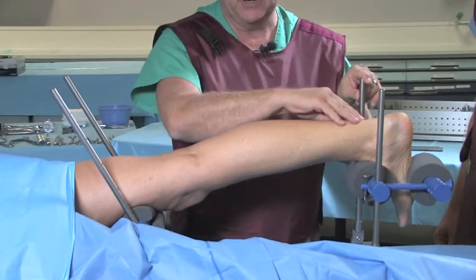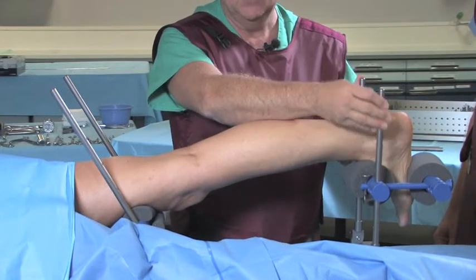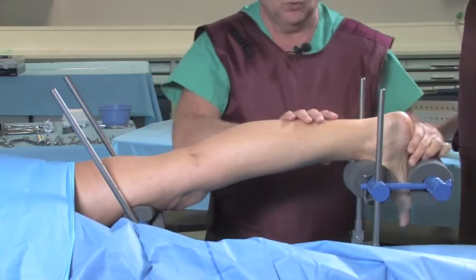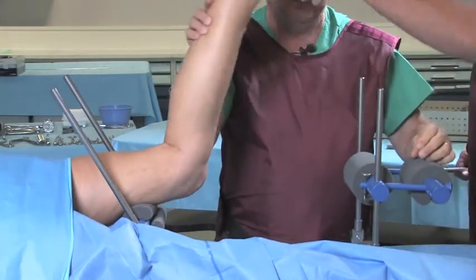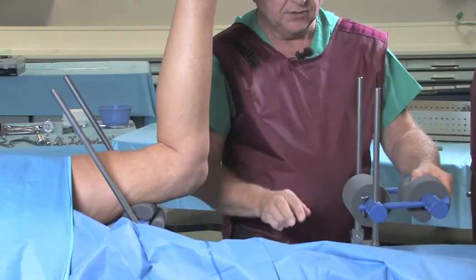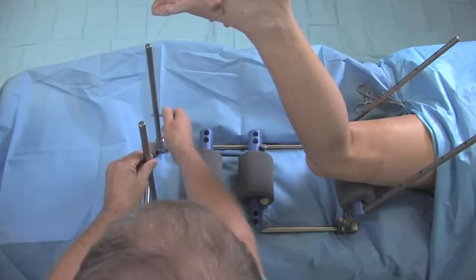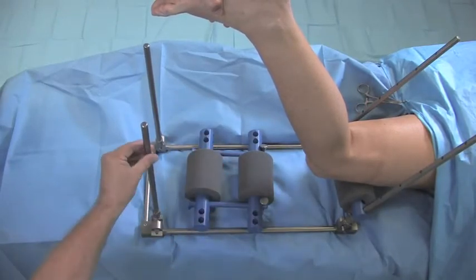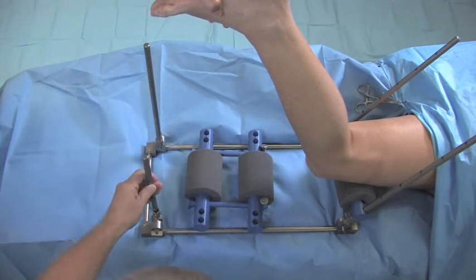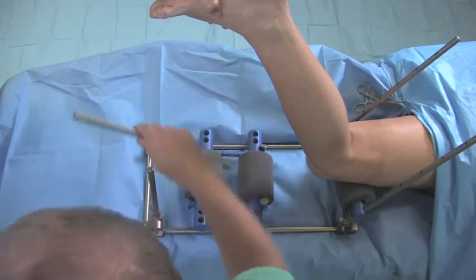Frequently, the access area may be compromised, and x-ray visualization may be compromised by the longer support bars. In that situation, we'll lift the leg back up. I'll lift this frame assembly out. We'll remove the medium support bars and replace them with two of the short goalpost bars.